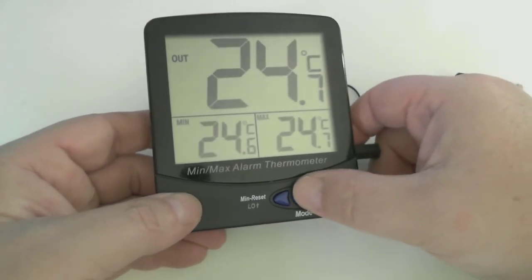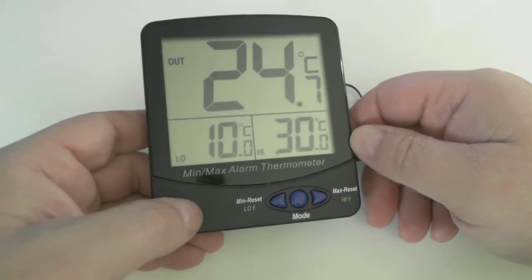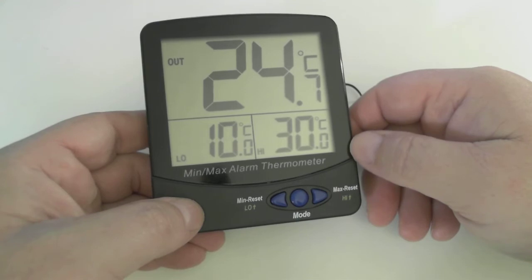To set your alarm set points, hit mode. You're now in the alarm setting screen. You currently have a low temperature of 10 degrees C and a high temperature of 30 degrees C.